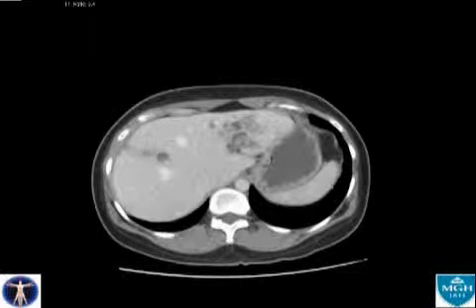This 50-year-old woman was referred for management of oriental cholangiohepatitis. She has had a history of recurrent episodes of cholangitis and has undergone a series of ERCPs in an attempt to remove her multiple stones. Since the bulk of her refractory stone disease is present in her left biliary system, as seen in this CT scan, a decision was made to proceed with a left hepatectomy.